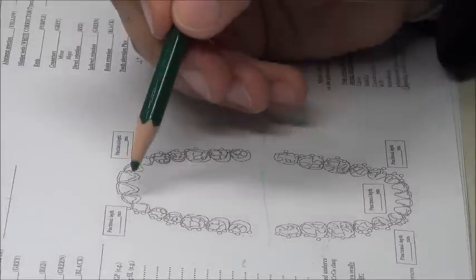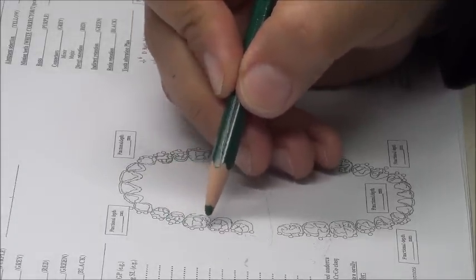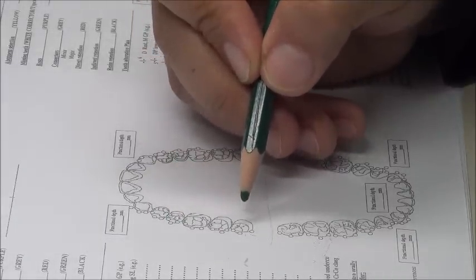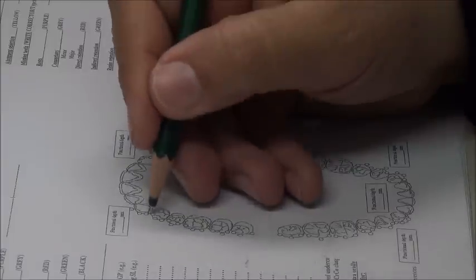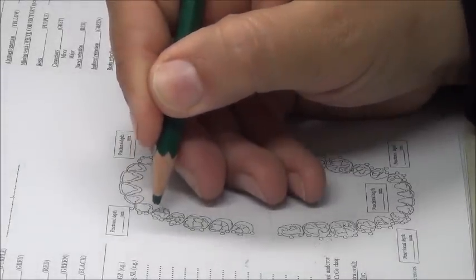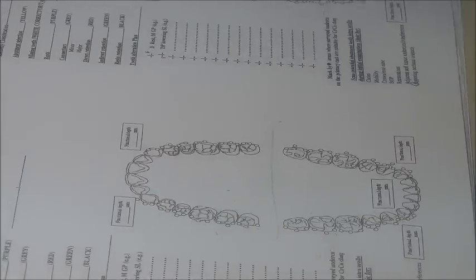Okay? So when I want to fill in, the design form has empty circles. Can you see the empty circles around the teeth? These empty circles around the teeth tell you where my suitable undercut is. So after surveying, wherever you find your undercut, put a mark on it. You fill in the circle, saying that my suitable undercut is here. Understood? This is how to fill the form.